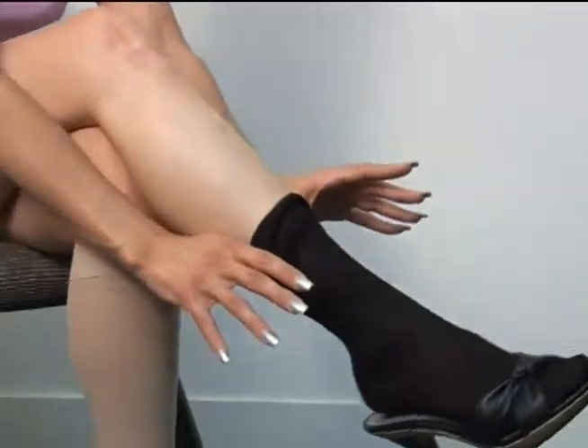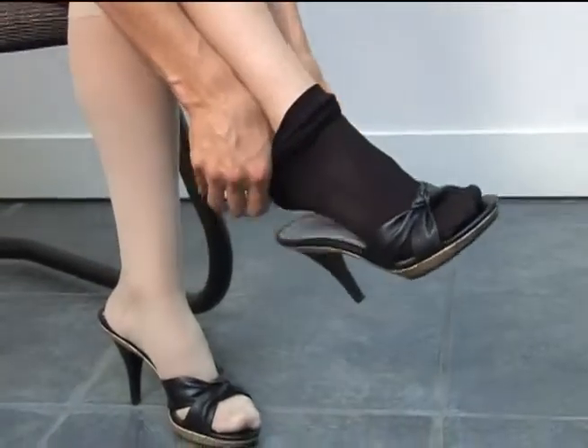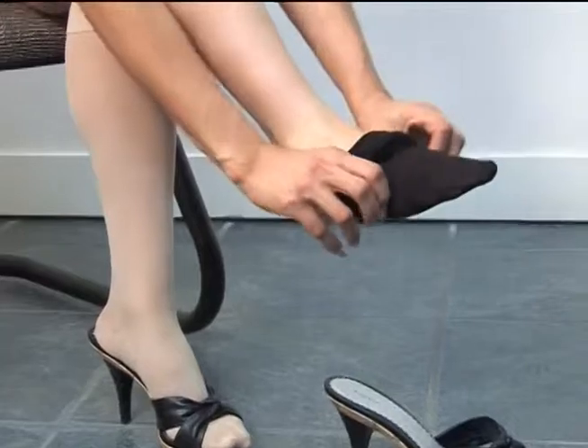To remove the stocking, be careful not to puncture the stocking with your nails. Move down the leg, bring back over the heel and ankle, then gently remove past the toes and remove the stocking.